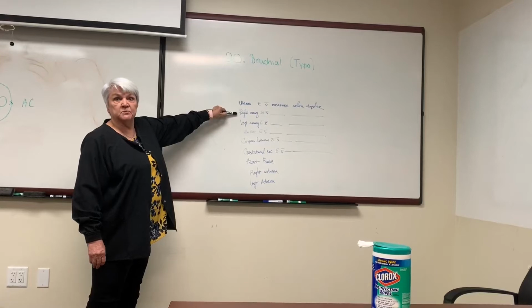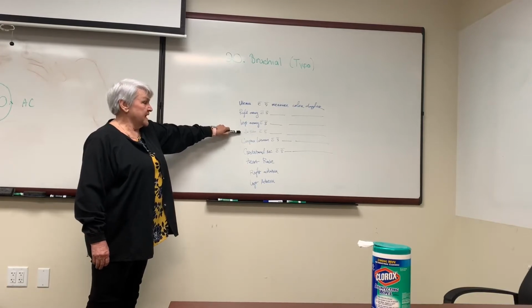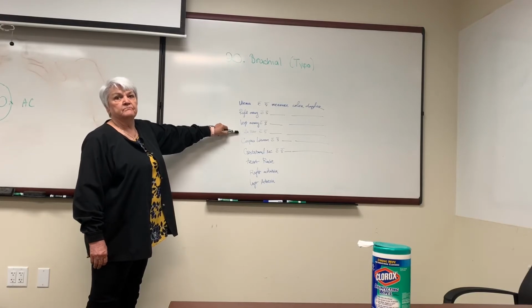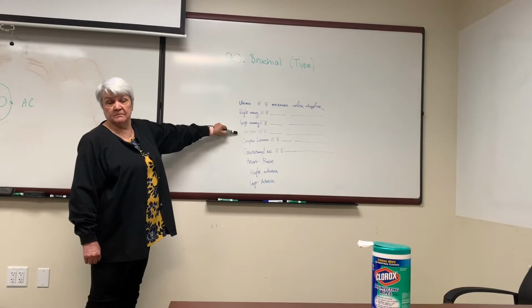Without measurements, with and without color. Left ovary, with and without color, with and without measurements. Yolk sac, where's that going to be? Yeah, inside the gestational sac, and the gestational sac is where? The fundal endometrium. Fundal endometrium.